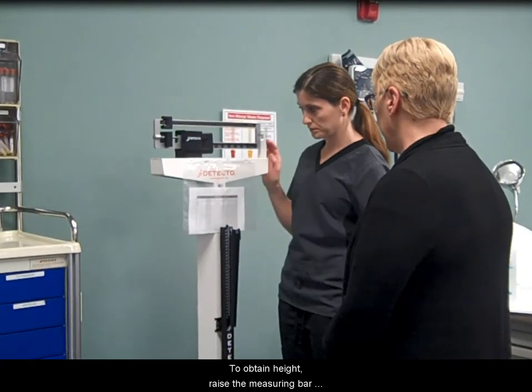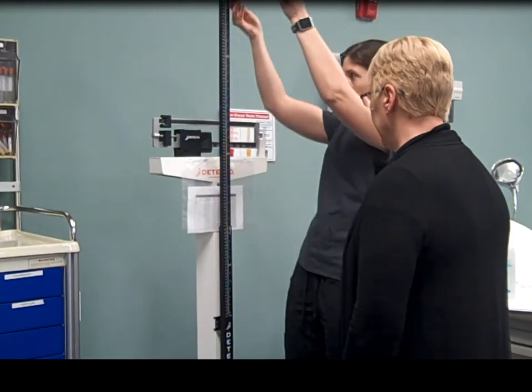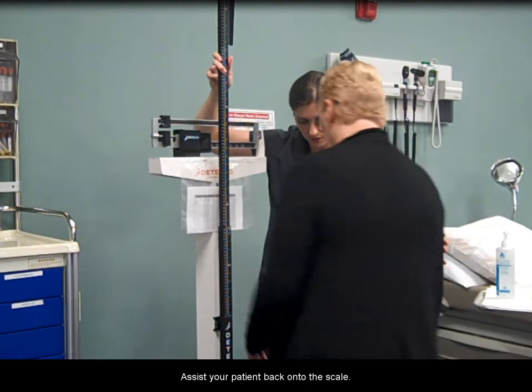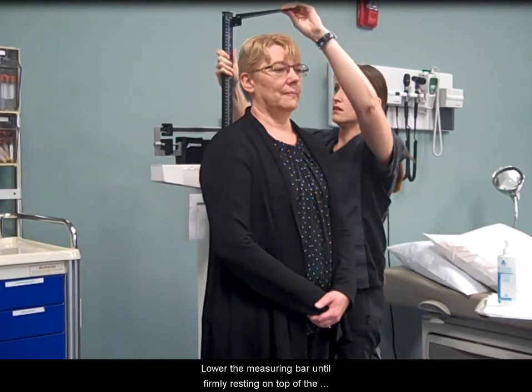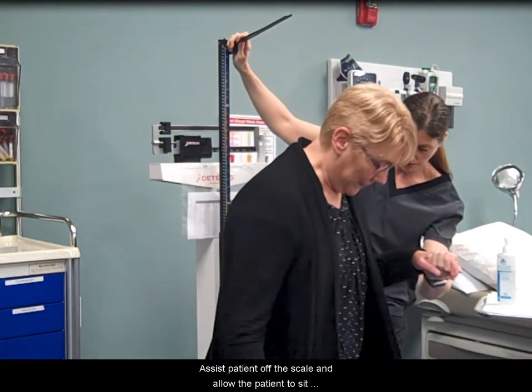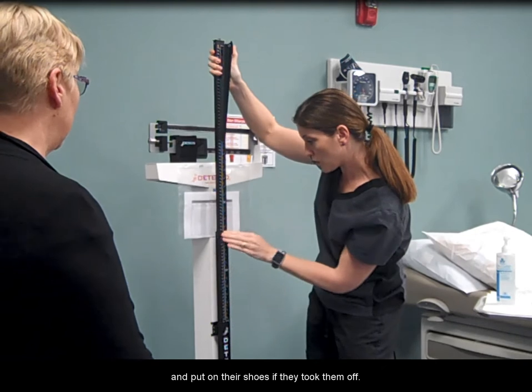To obtain height, raise the measuring bar beyond the patient's height and lift the extension. Assist your patient back onto the scale. Lower the measuring bar until firmly resting on top of the patient's head. Assist patient off the scale and allow the patient to sit and put on their shoes if they took them off.